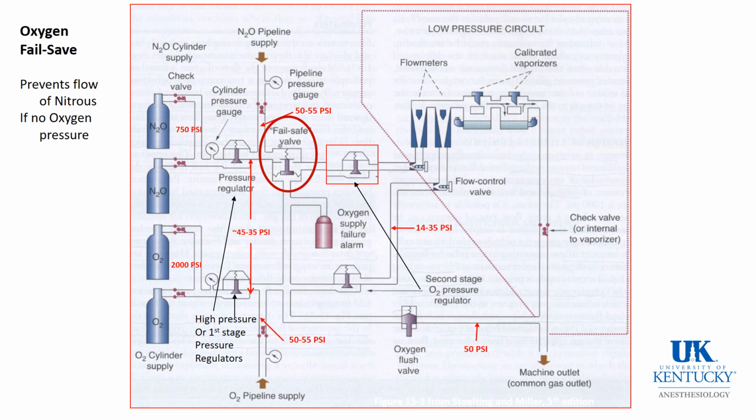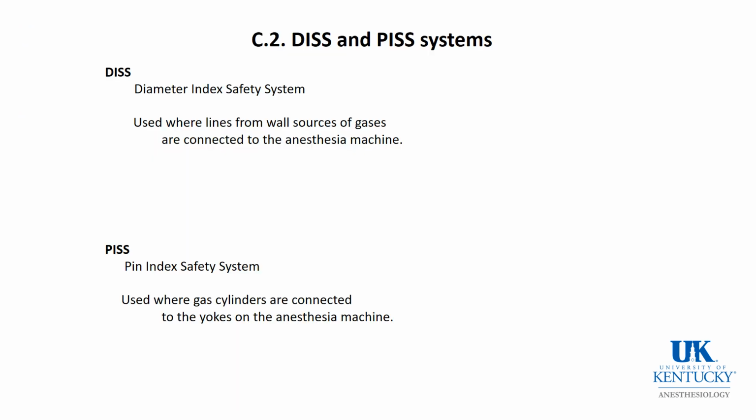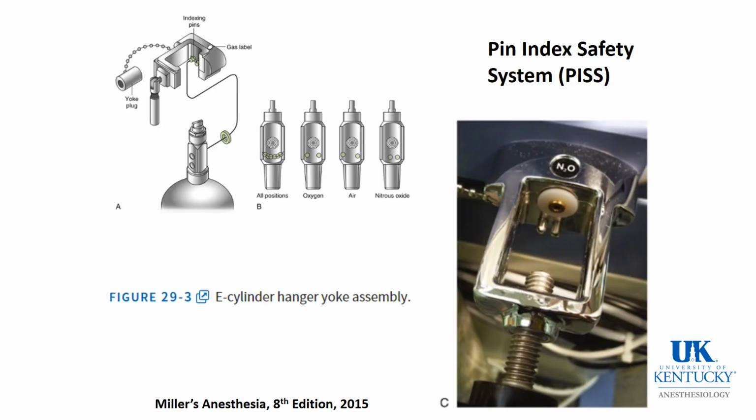I sort of fumbled my description. I'm sorry about that. The problem with this system, of course, is if you knock off these pins, either maliciously or by accident, you could then put any tank on there. So read the labels.